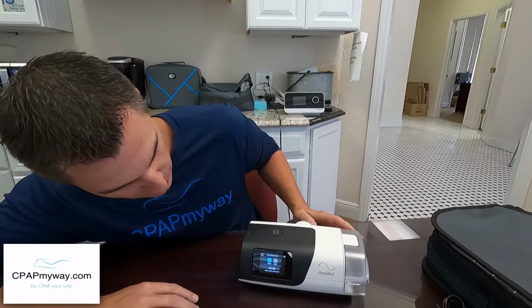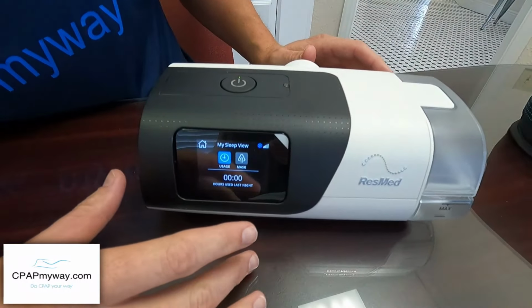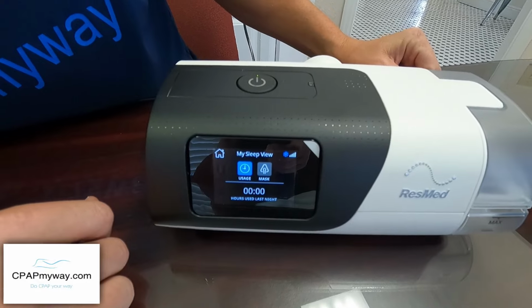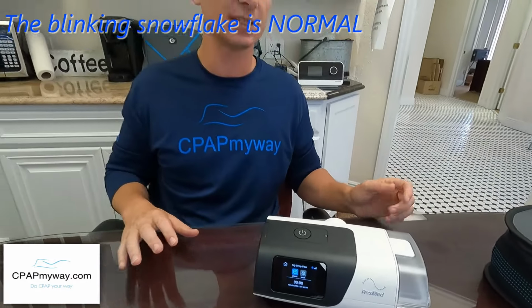One thing of note when you first shut it down is it will obviously go to this sleep report, which is a little different than the AirSense 10, but in this top right, I want you to notice, hopefully the glare is not messing it up, but there's a blinking snowflake. That blinking snowflake is normal. It just means that the machine is cooling down. It goes through a cool down after every time you turn it off. We get people calling in all the time wondering about the blinking snowflake. It's normal. Do not worry about the blinking snowflake.